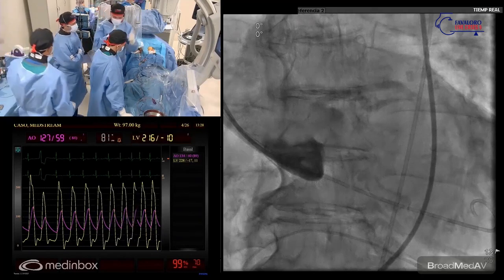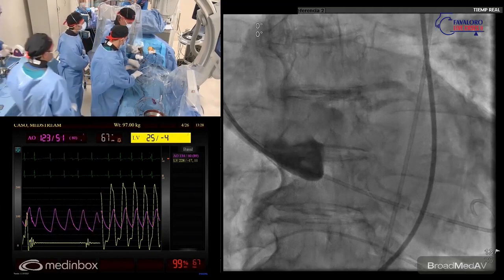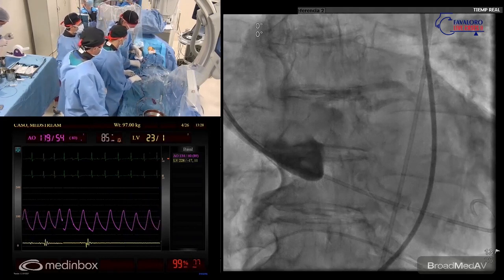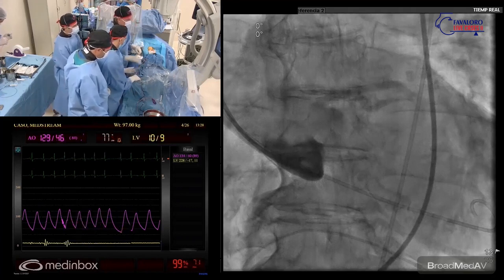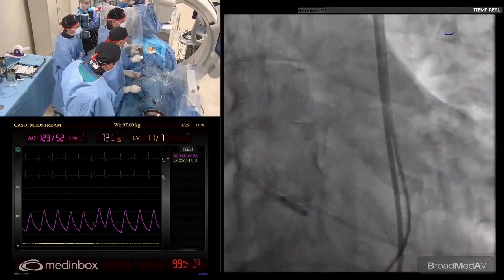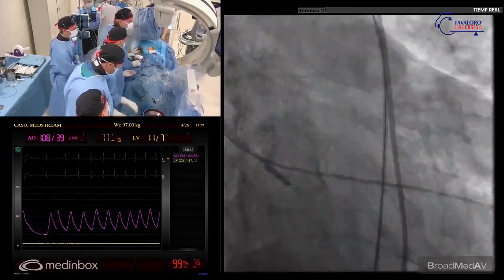Well, it's good too. This is the importance of live cases. And particularly in this lady with a bit of a large groin, I think it's a good idea to use two ProGlides, because it's not easy to realize that the patient is bleeding. Yeah, we have had cases, and actually in a live case, that everything was okay on the surface, except there was a retroperitoneal bleeding, which is not that easy to see in such a huge lady.